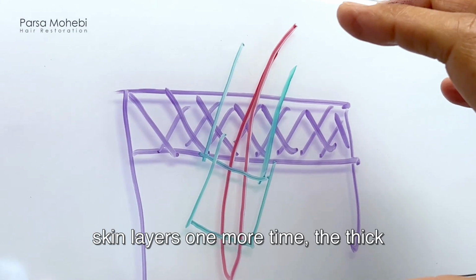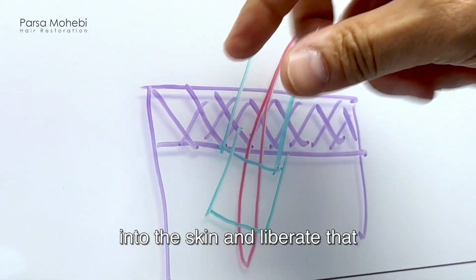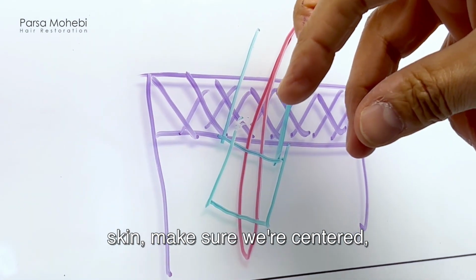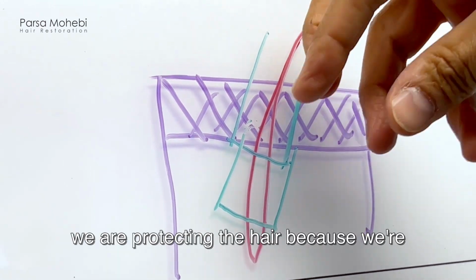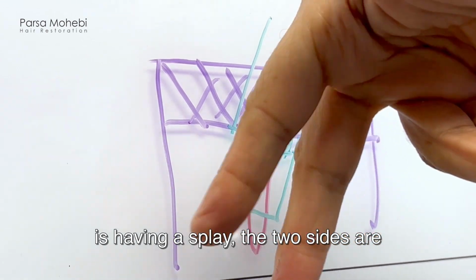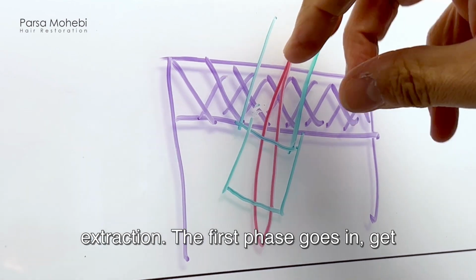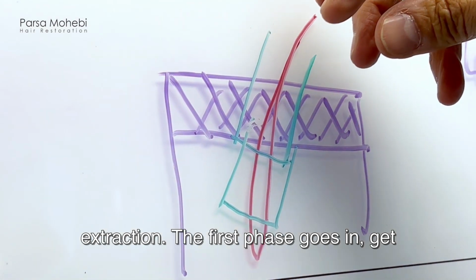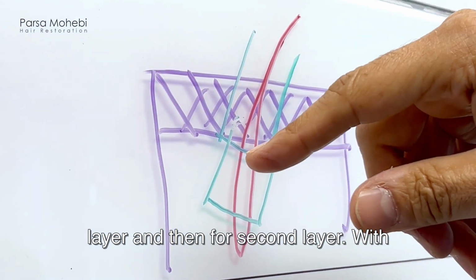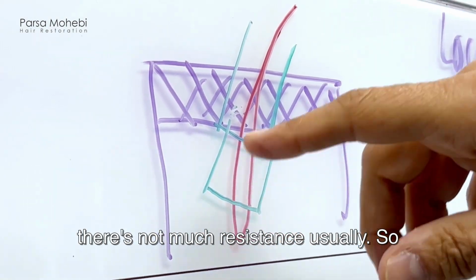So looking at the skin layers one more time, the thick layer of the skin, we did rotation to go into the skin and liberate that superficial layer. So cut through the skin, make sure we're centered, we are protecting the hair because we're not going all the way in. So if the hair is having a splay, the two sides going away from each other, it's not going to affect our first phase of extraction. The first phase goes in, gets lodged into the skin, cuts the superficial layer, and then for the second phase we're switching to oscillation or Mamba mode, and we go in and out real quick because there's not much resistance usually.